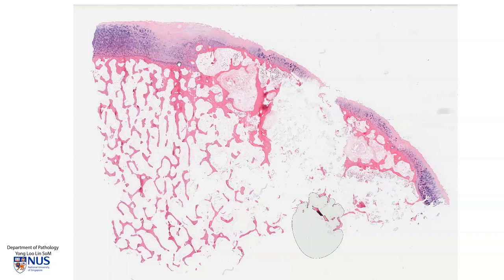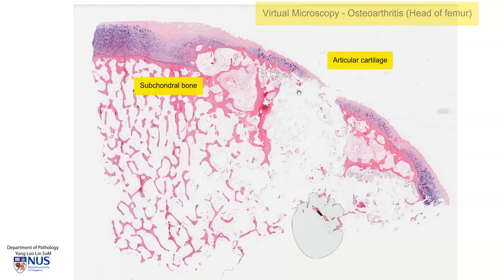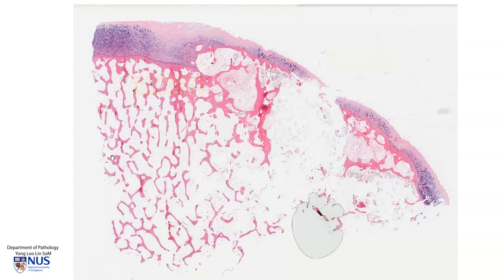This is a virtual microscopy slide of the articular surface of the head of the femur. I am outlining here the articular cartilage, which is quite abnormal. And then here we have the subchondral bone, which is the bone just deep to the articular cartilage. In this region, we see fairly normal appearing cancellous or spongy bone, and there is some fatty marrow in between the bony trabeculae.